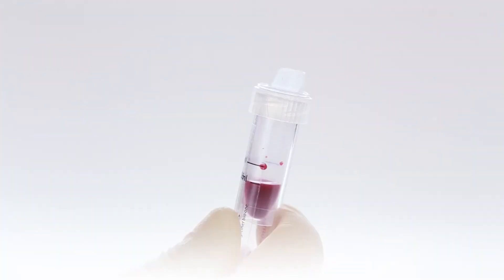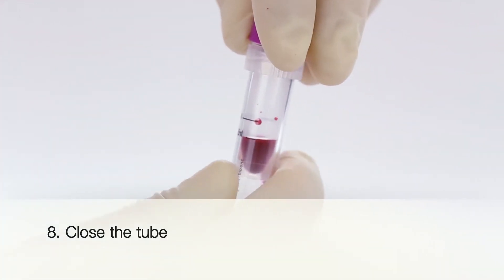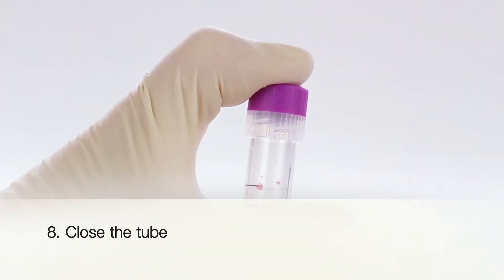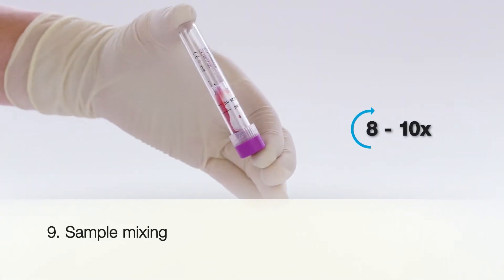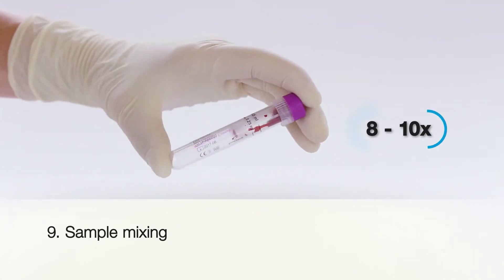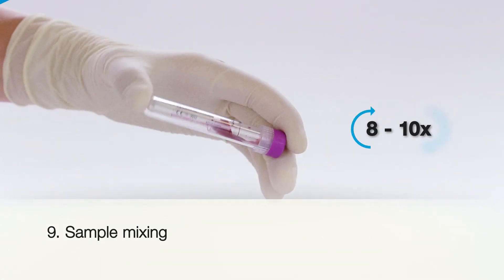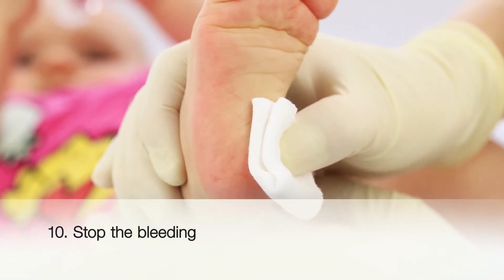When you have collected the required volume of blood, close the cap again. A clear audible click means that the tube is properly and completely closed. Gently invert the MiniCollect tube eight to ten times immediately after collecting the capillary blood sample. This ensures that the blood sample is mixed thoroughly with the additive. Stop the bleeding by pressing with a gauze pad.